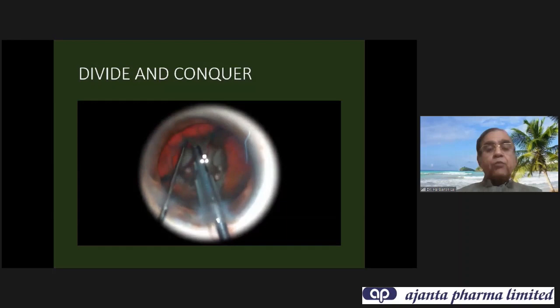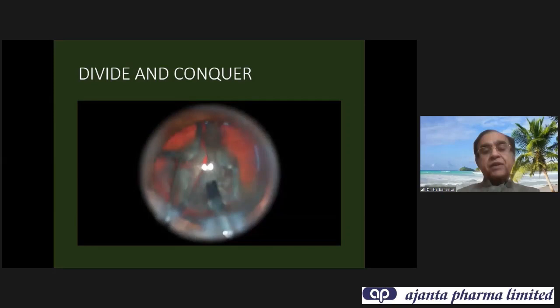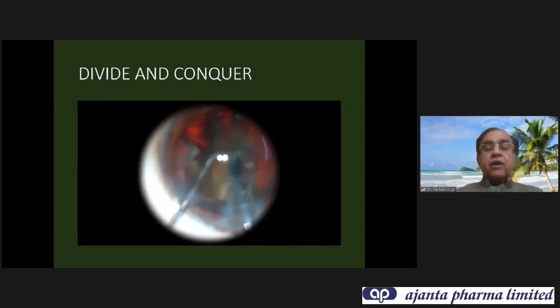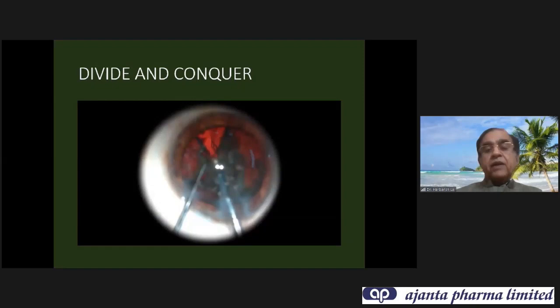You can do both parallel or in a cross pattern. Once four nice pieces are created, go and nudge the nucleus, give phaco energy to bury and pull it out. Further divide it — if the nucleus is harder and bigger, make pieces as small as possible. Every nuclear fragment will be further subdivided into two or three parts and emulsified.